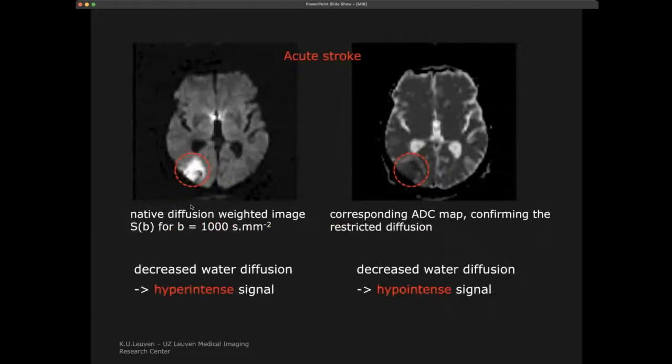And that's one of the most interesting applications. Here is an application where we look at the amount of diffusion. Depending, for example, on the lesion, there might be lesions that still have the same water content, so on T2 or T1 they would look very similar. They might be structurally slightly different and have slightly different local diffusion. And so this is what you can do.